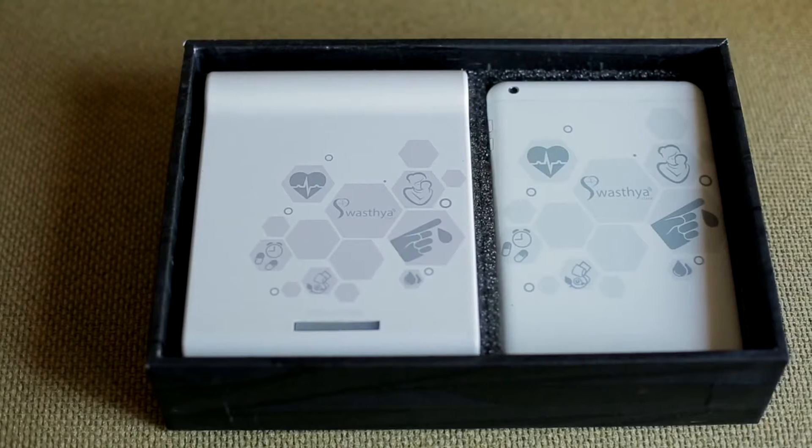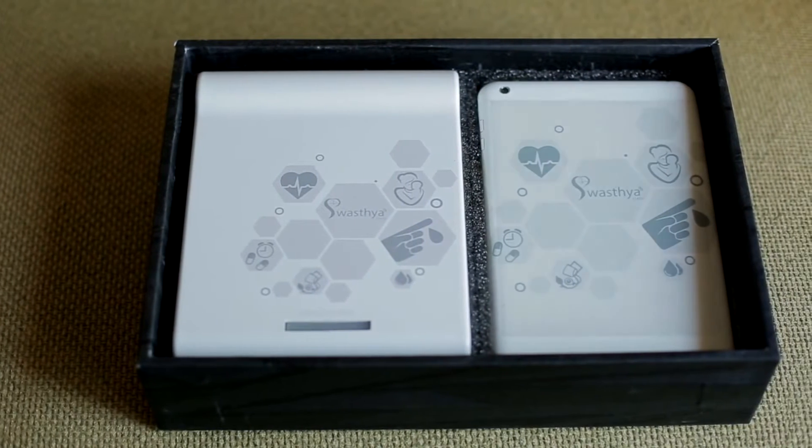And when the doctors actually receive them, they have enough information to proceed with the treatment as appropriate. Therefore, the Swasthya Slate actually provides the bridge between the health workers and the doctors to enable the doctors to treat more patients in a much more efficient manner.